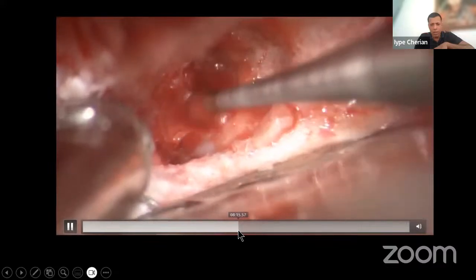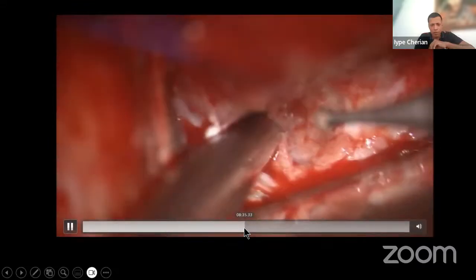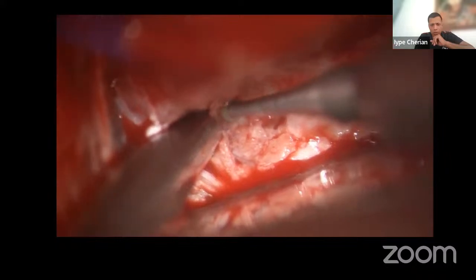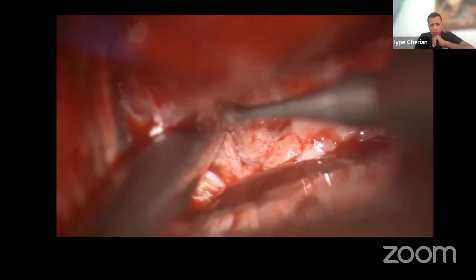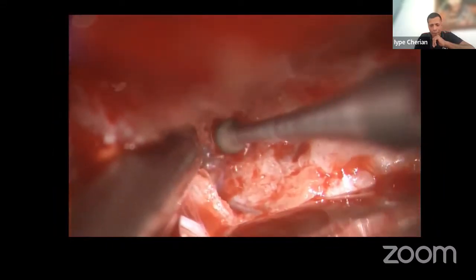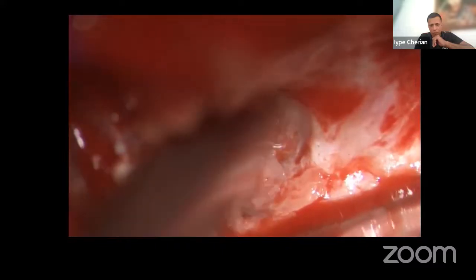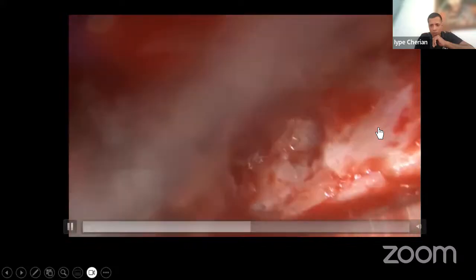So in this case, having a dural breach would not be good. So using the 2 millimeter drill first, then 1 millimeter, and then a 0.75 millimeter drill, under very high zoom. You can see that the optic nerve is here, it's massive. So this is near 40 zoom.